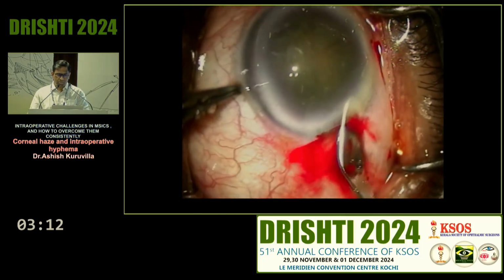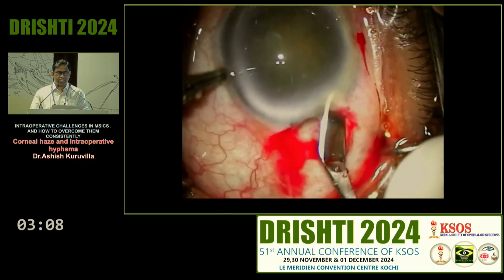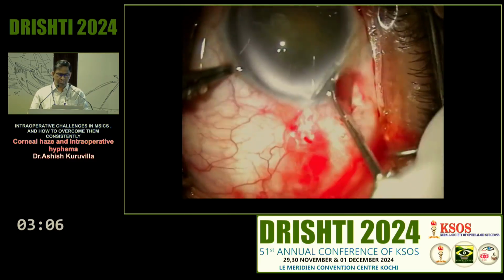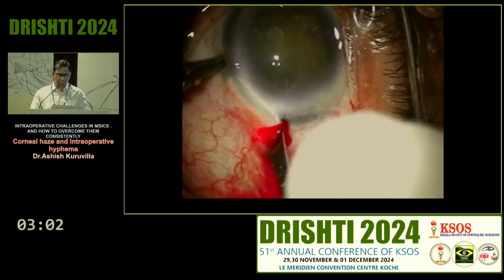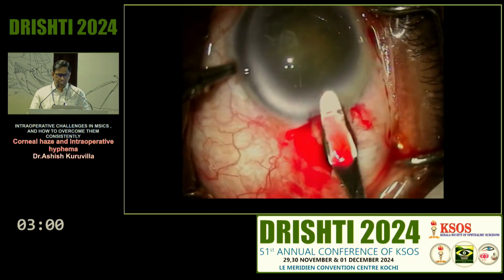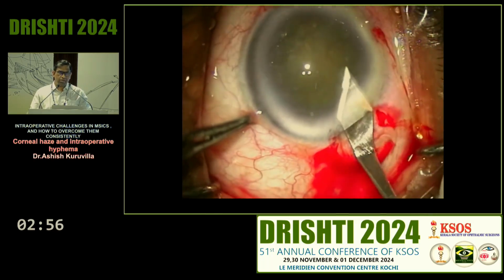That is in a normal cornea. When you have a severe degeneration like this, you should be careful. The apposition of the corneal lips or the valves is not as good as in a normal healthy cornea. Somehow these corneas behave a little differently. So this kind of stunt really doesn't work well when you have a corneal degeneration.